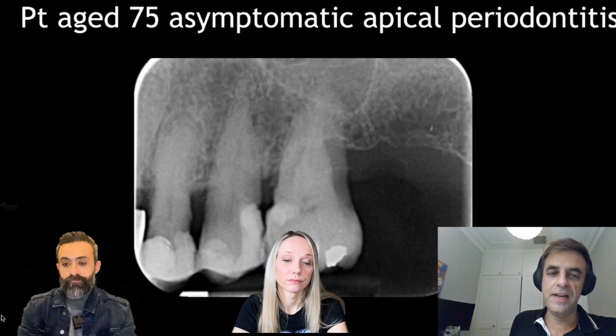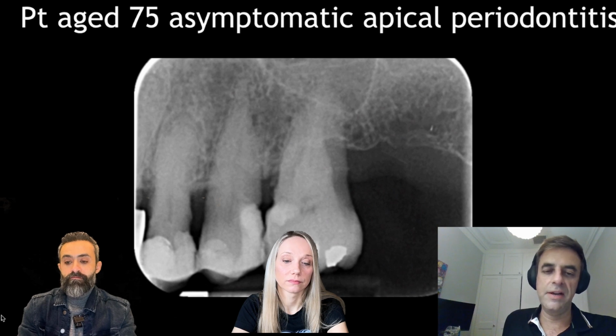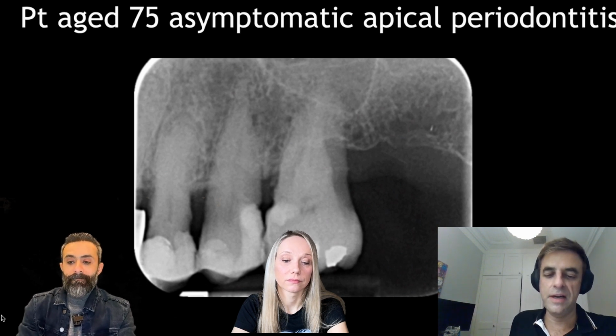So you tend to get a funny blurriness around the restoration, and sometimes you're not quite sure if there's a crown margin where there's caries, and sometimes you can't quite see. And the other thing is, CBCTs don't tend to show density differences as well as a 2D radiograph. So if there's a fractured instrument in the root canal, then a CBCT is less useful.